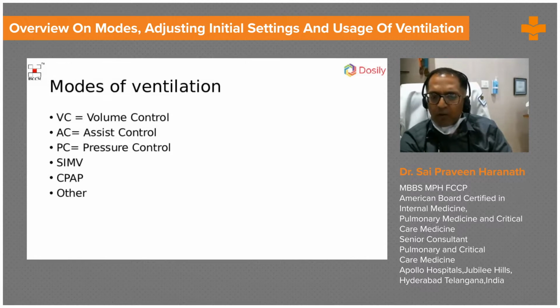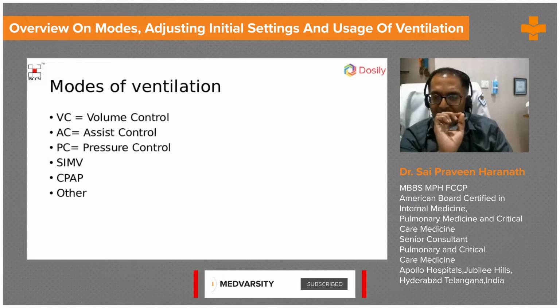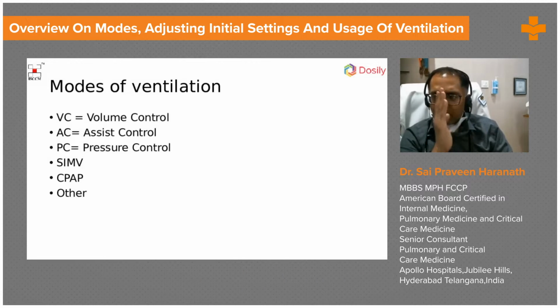And we'll talk about how the machine knows when the patient wants a breath. So the machine can say, okay, the doctor has set the number to be, say, 10, which means that over a minute, 10 times the breath will come out. Suppose you set it for 12. Every 5 seconds, you're going to get a breath, for 12 times 5 is 60.